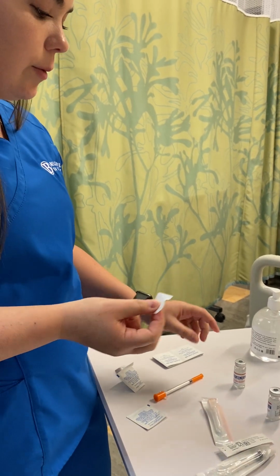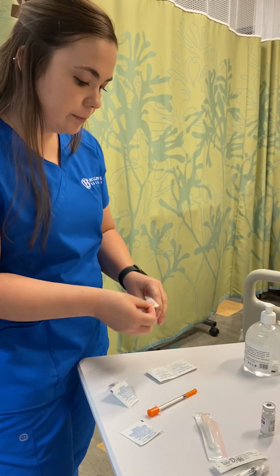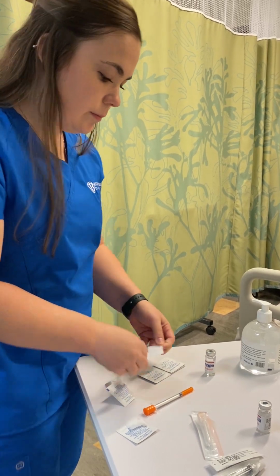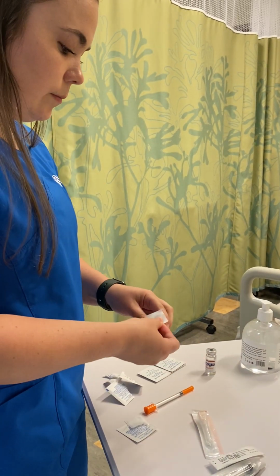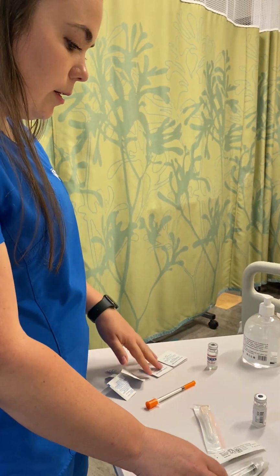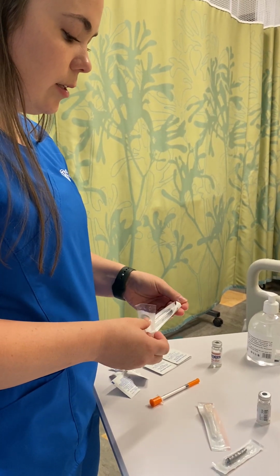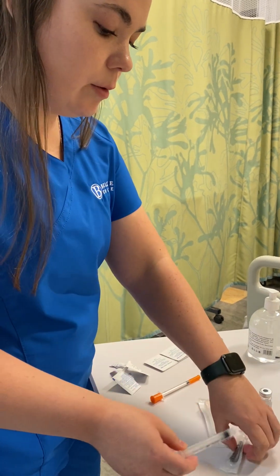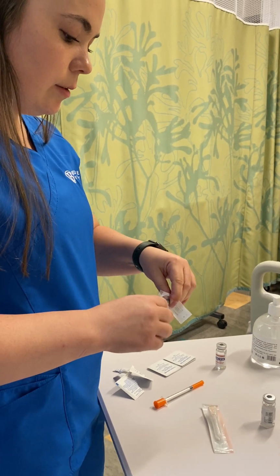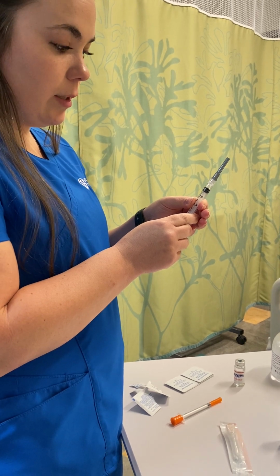I'm using an alcohol swab after taking off the top of the vial. I would clean, and make sure that it dries. Starting with our flu shot, I would select the appropriate size syringe. I would put on a blunt tip needle to draw up the medication. I would withdraw the appropriate amount of air of the medication that I'm going to be giving.